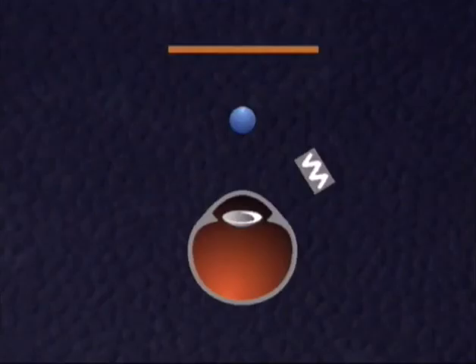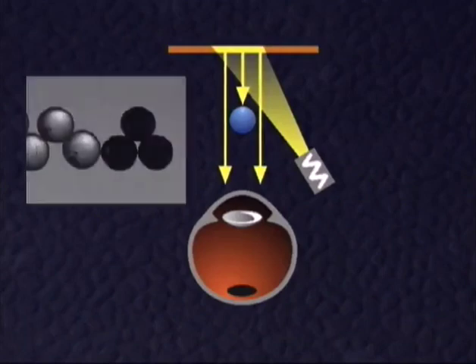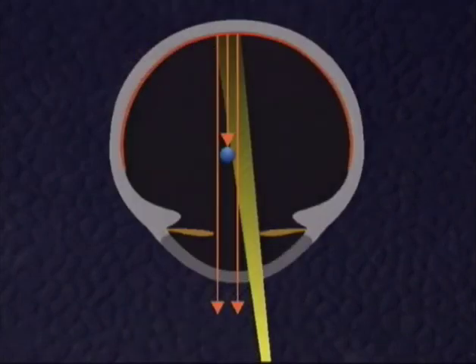In this technique, the observer identifies absorbing objects. Such objects always appear black when seen in backlight, whatever their own color and whatever the color of the backlight. How can absorption phenomena be generated? Retroillumination is used similarly to the examination of refracting phenomena from the iris, from the lens, as well as from the fundus.